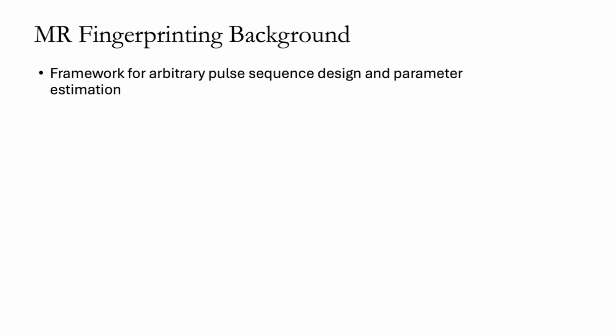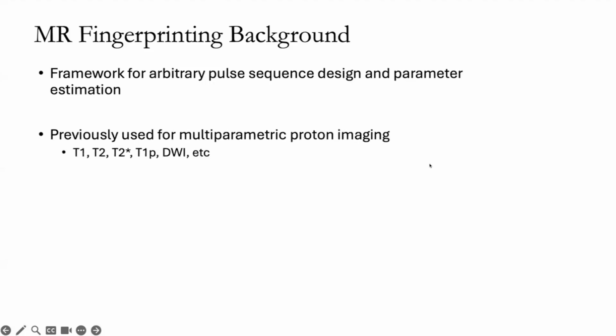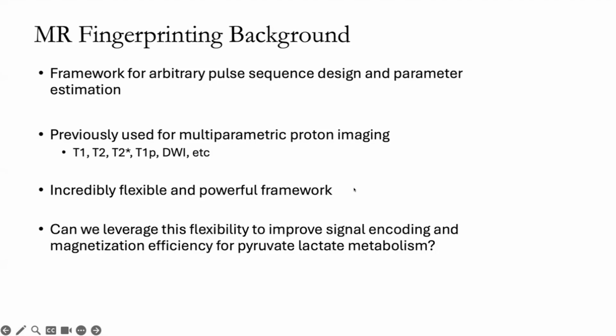And essentially, it is a very, very powerful framework for arbitrary pulse sequence design and parameter estimation. I think the pseudo-randomness has been kind of a distracting branding effect that a lot of people have talked about, but the true power of it really is this arbitrary pulse sequence design, that we can do anything, including pseudo-random methods, or any other method that we feel will best characterize our underlying metabolism.